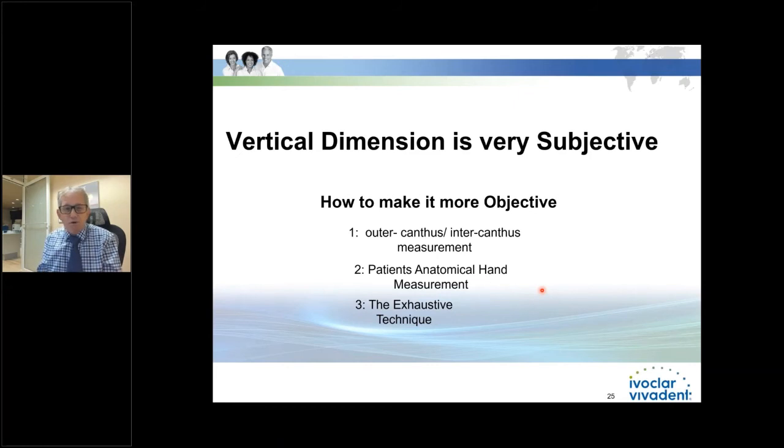It's just going to put you in a ballpark because we're going to actually take a preliminary centric occlusion to give to the laboratory. We've already given them measurements for the labial position of the teeth, the incisal edge of the teeth to make for their occlusal rim. So they're going to have that information. Now we're going to give them this arch, this inner vestibule area here, that inner arch distance right here. So that's going to be our 62, our 65, our 66 in there. And so they're going to make that upper occlusal rim, and then they're going to make the lower fitted.